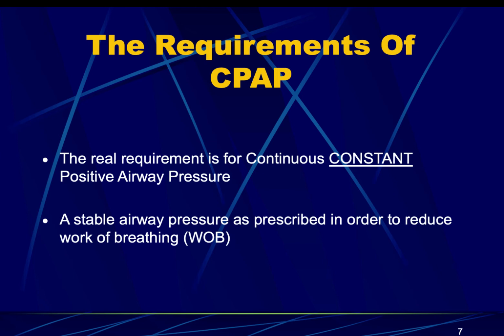It works very well. It's a process where you have to talk your patients through it. I don't know if you guys have ever had the opportunity to actually put on the CPAP mask, but it is kind of scary at first, and you just have to reassure the patient that this device is there to help them. Once you get them to try it and put that mask on, have them hold the mask themselves if they are able to, and adjust that mask. Once they start breathing in, they will also realize the benefits of the CPAP machine itself.